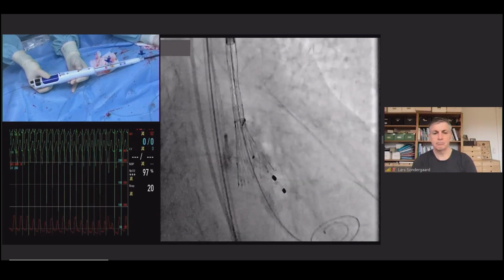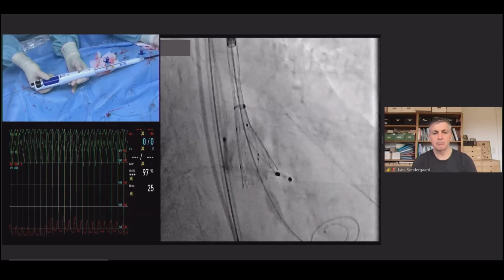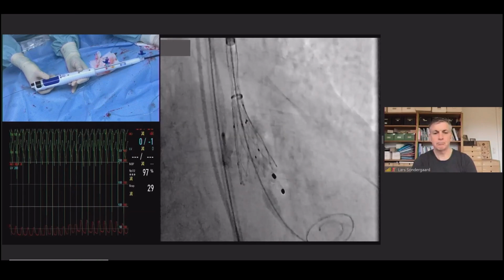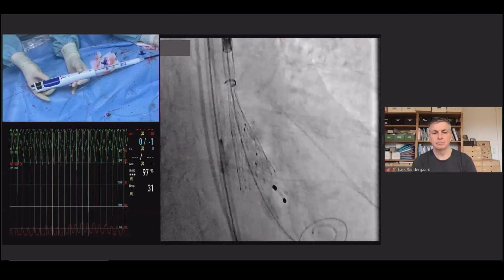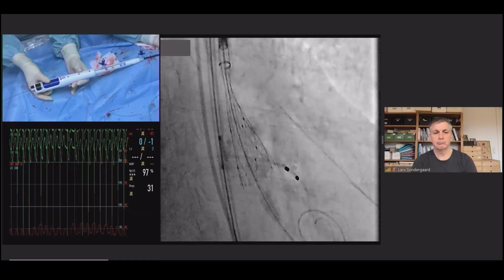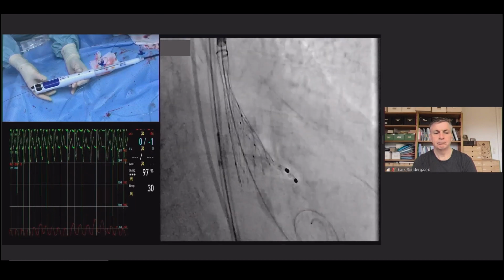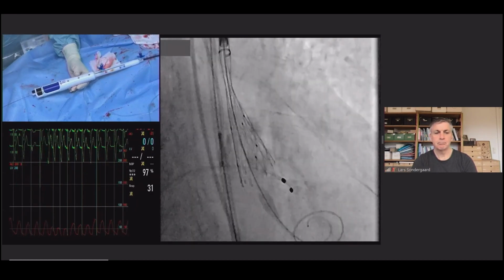No, I don't think so. It's okay. No, the calcium is lower than the pigtail. Yeah, okay, I think it's fine. Pressures are low, but they will be recovering. And you can go down to 120. Go down to 100. Stop here. Yeah, I would stop here too. We'll try to come off pacing.